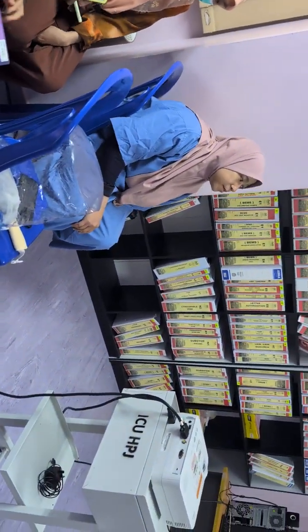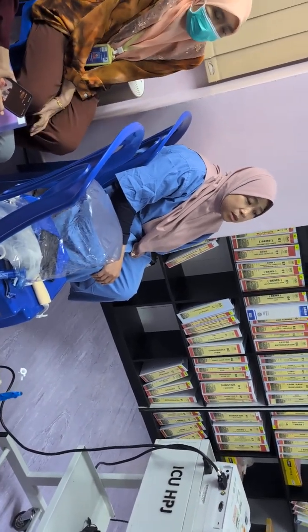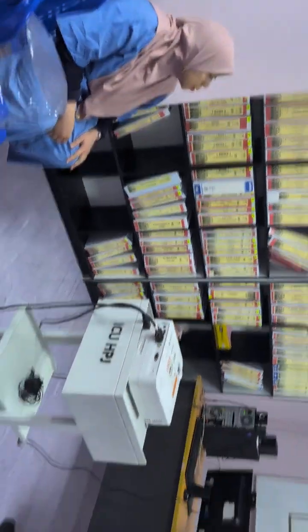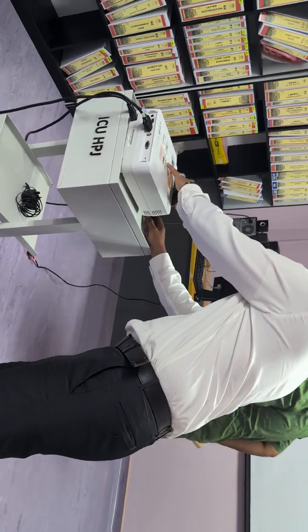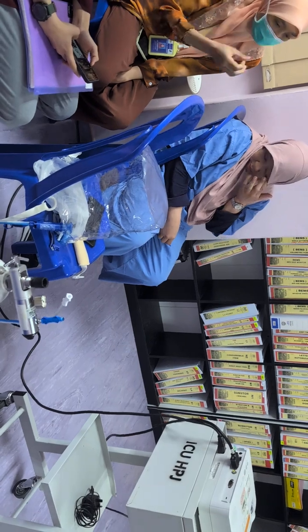Any question on non-invasive? Just very quickly, I'm going to talk to you about invasive stuff and then we're done. As I told you, I am an airway guy. Okay? So we started with the GlideScope a couple of years ago.